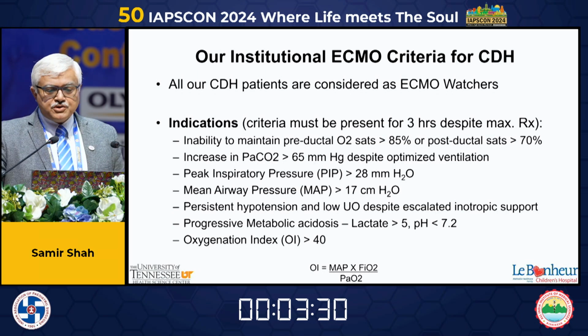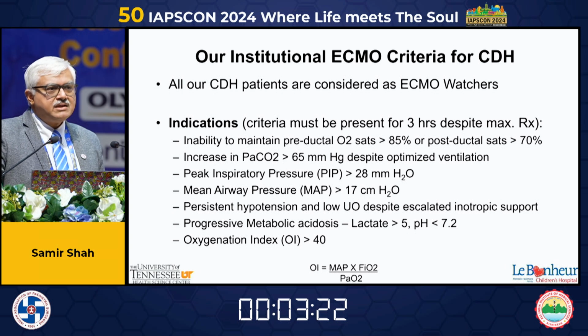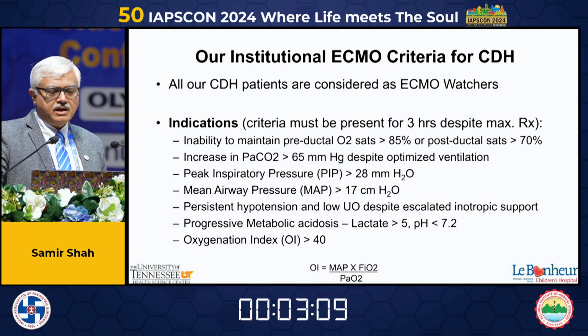What is our institutional criteria for putting patients on ECMO for CDH? They're listed out here. I won't go through all of them, but the indications and the criteria need to be present in these patients for at least 3 hours, which essentially tells us that we have done maximal medical management in these patients. They could include hypoxia, hypercapnia, hypotension, or lactic acidosis.